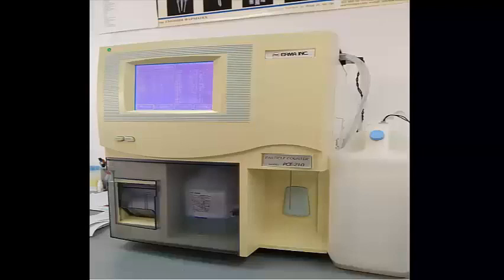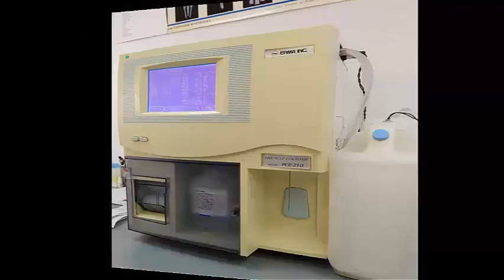Operation principles of the device. The electronic cell counters that measure blood characteristics are divided into two main groups. The first group measures the change in the electrical impedance of the solution when the blood passes in front of a hole, and the second group is based on the light refraction due to the blood cells.